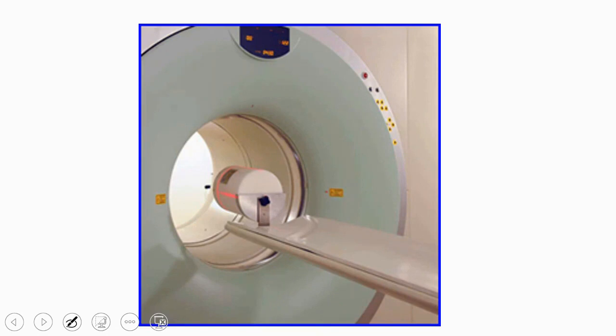Why quality control? He performs something called a blank image. What is this blank image? First, it ensures that all the detectors, all the rings, or all the crystals are functioning efficiently. It ensures that he creates a specific image that he uses to apply correction to the images of the patient.